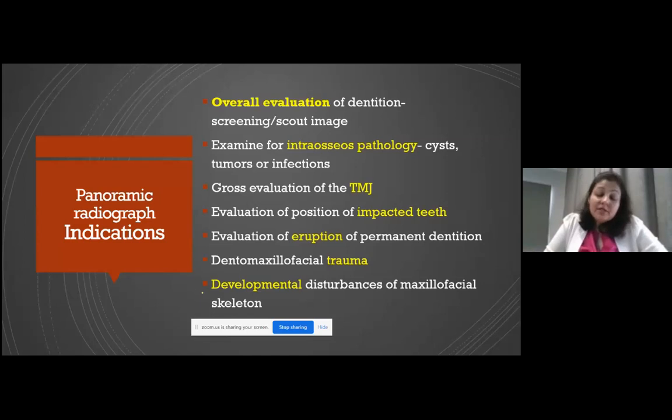Right, because it's important to understand that this is actually a plain image, a plain radiograph. Next, it is excellent for evaluating the position of impacted teeth. It gives you an idea of the overall appearance of where the impacted teeth are located.